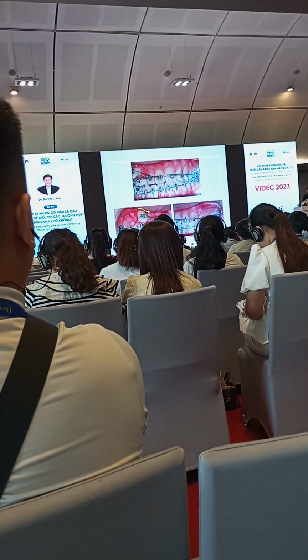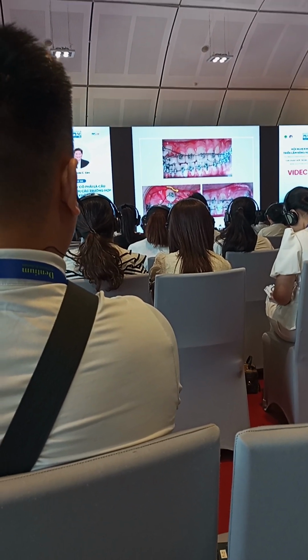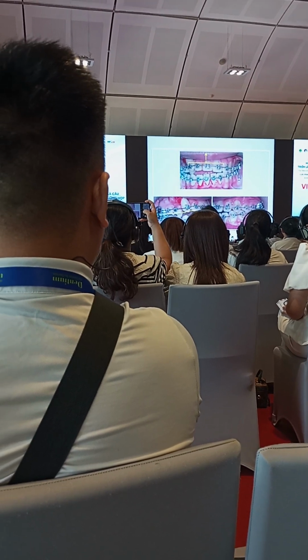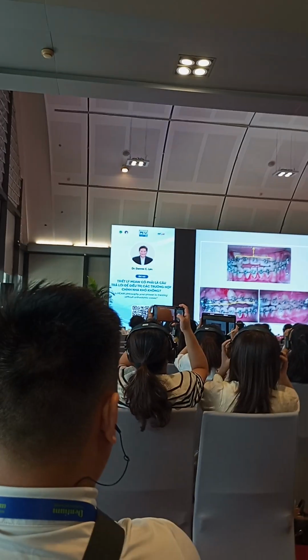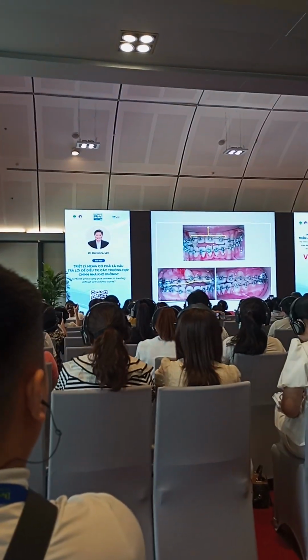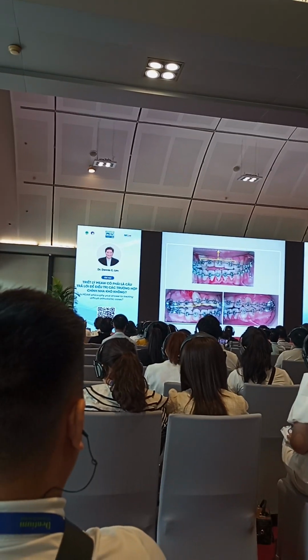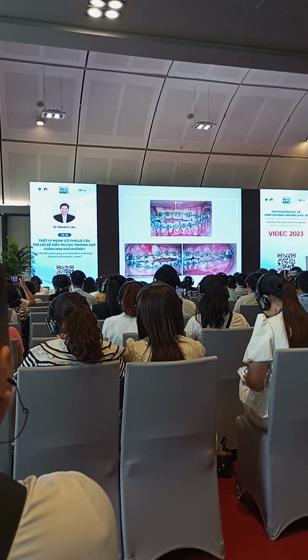But when the patient came back after 1 month, I was shocked, okay, with what happened. There is now a canting of the occlusal plane. My anterior segment, especially on the canine area, had an open bite. Okay. So there is now a canting, okay, of my wire.